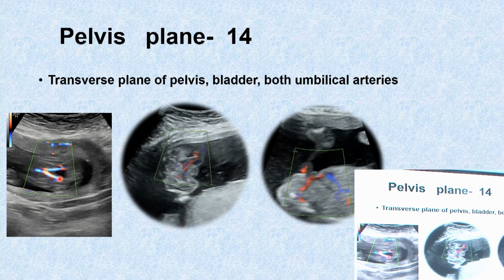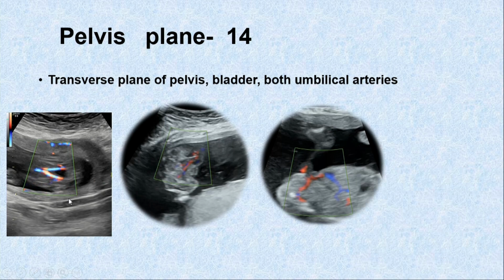So what they have recommended is that when we start any fetal examination, we have to look at the two major dynamic structures, the stomach and the urinary bladder, at the beginning itself. Once you see that and take the images of that, then it's okay. If you start visualizing them at the last, and you don't see these structures, again you have to wait till the structures are filled. Therefore we need to start visualizing them early itself. We have to look at the bladder in each and every case.